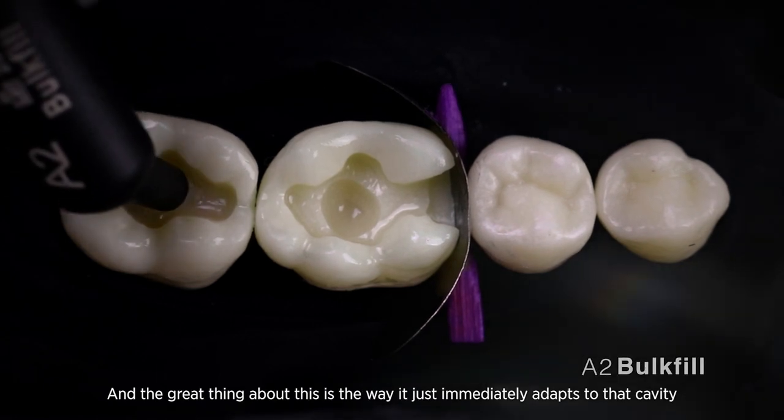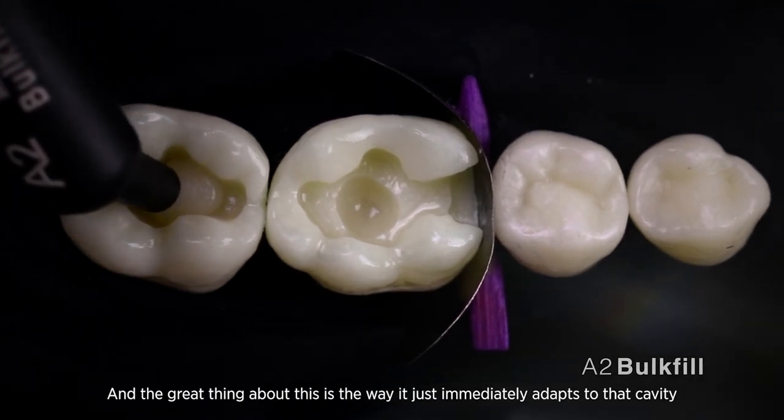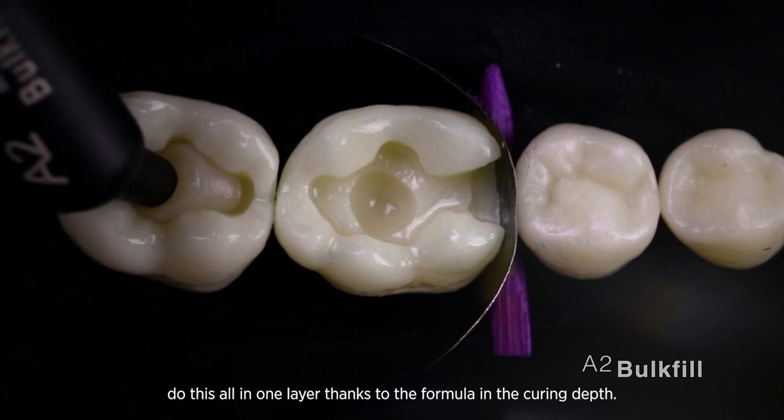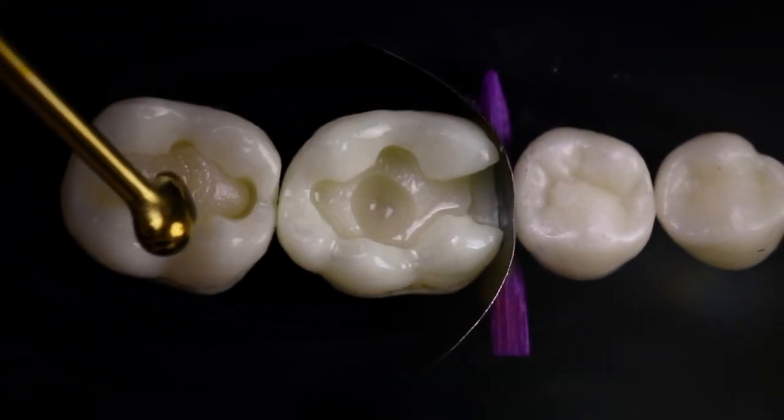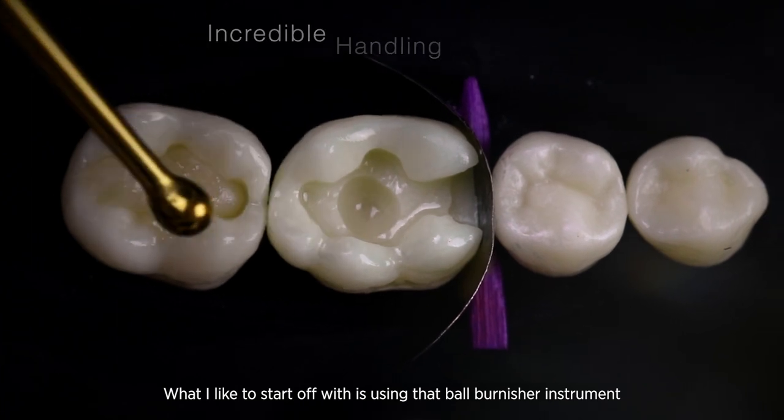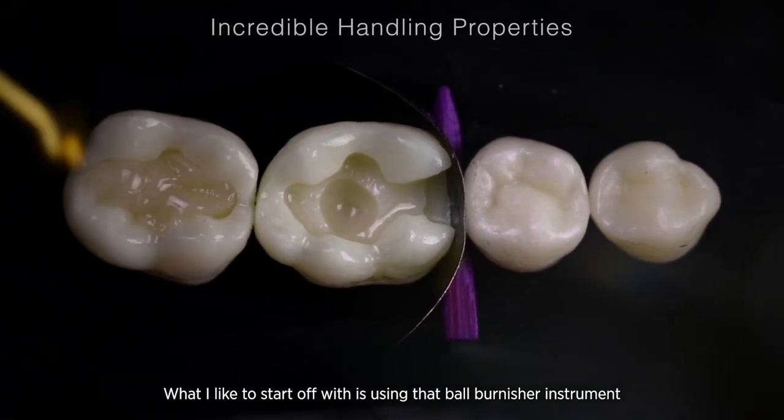I'm going to start on that second molar tooth with my bulk fill. The great thing about this is the way it just immediately adapts to that cavity, and I'll be able to do this all in one layer thanks to the four millimeter curing depth. I like to start off with a ball burnisher instrument just to get that initial adaptation.